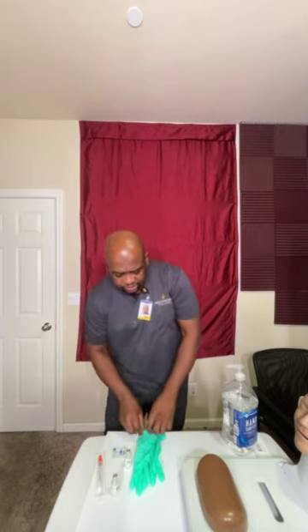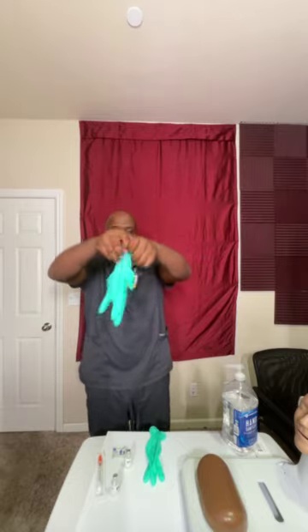I already checked the medication earlier to make sure that it's safe, meaning that the color hasn't been compromised, the content hasn't been compromised, the expiration date, everything is good. As I said, it has to be at room temperature, but we also want to mix this medication. What we don't want to do is shake the bottle up. Let me first put my gloves on. Let me do hand sanitizer, clean my hands. Hands are clean, right? Now that I've done hand hygiene with the hand sanitizer, I'm going to go ahead and put my gloves on.